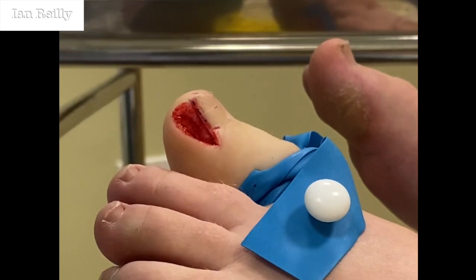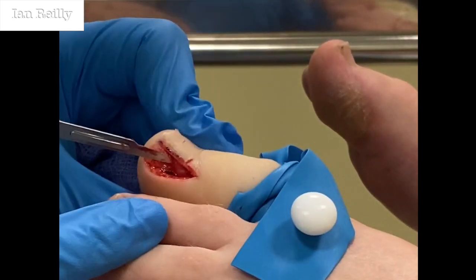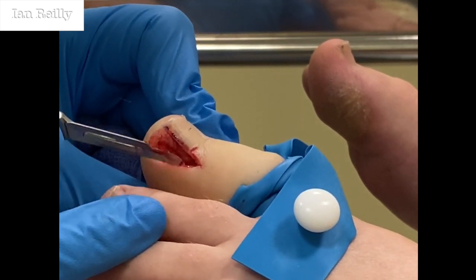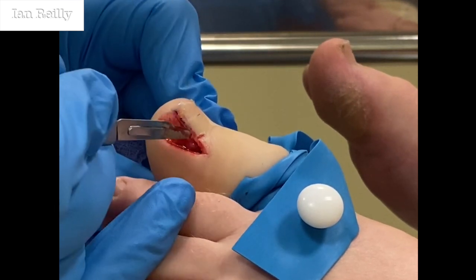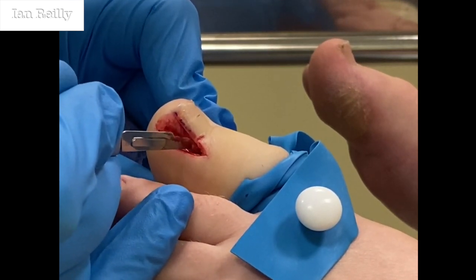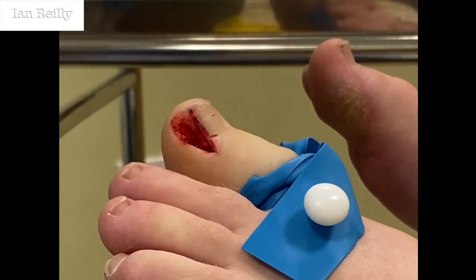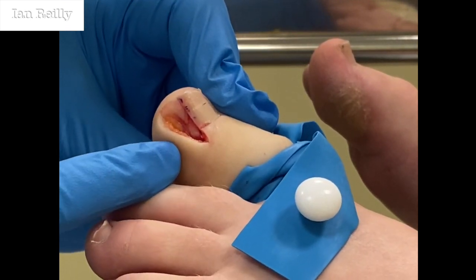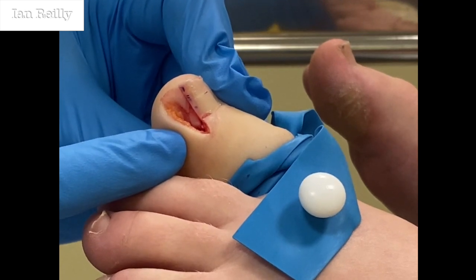So, as I say, really a little mini VANDENBOS, to take all that section out. So the nail root is there, and that's just going to close up, and it's just going to be away from that side of the nail. So Sophie, you'll probably find that little bit of nail will regrow. But the problem, really for you, was this tissue on the side. So it's quite a wound. In many ways, I think it heals quicker than when you'd had the nail surgery before.